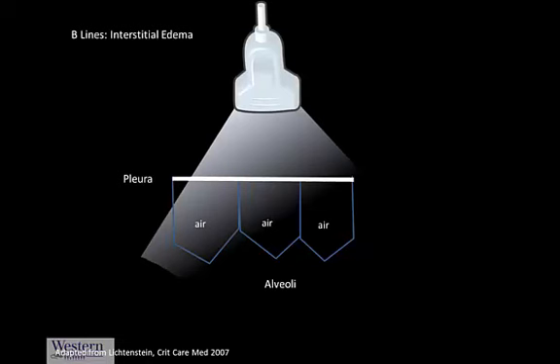So the ultrasound beam is cast through the alveoli here, which are shown in schematic, and there's, for instance, thickening or fluid in the interlobular septae, and the ultrasound energy, as it pulses these small molecules, they vibrate and reverberate, and they constantly send back a signal to the ultrasound probe, and the ultrasound probe will interpret this as energy emanating from this point, but a constant energy, so it will plot bright pixels along the entire vertical length underneath those alveoli.